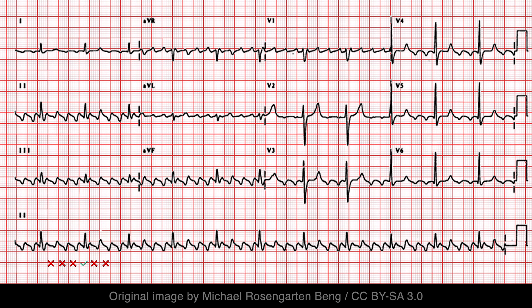Here's another example of atrial flutter with a 4:1 AV conduction ratio. Every fourth flutter wave results in a QRS complex. Since the conduction ratio is constant, the R-R intervals are equal and the rhythm is regular.